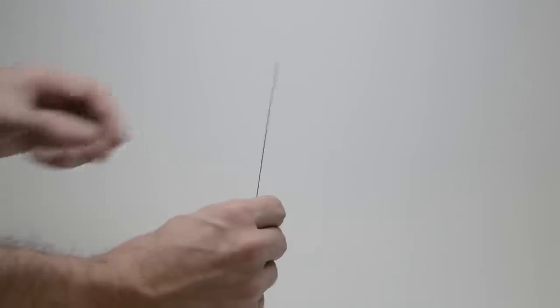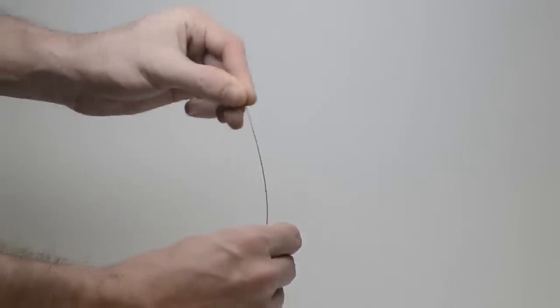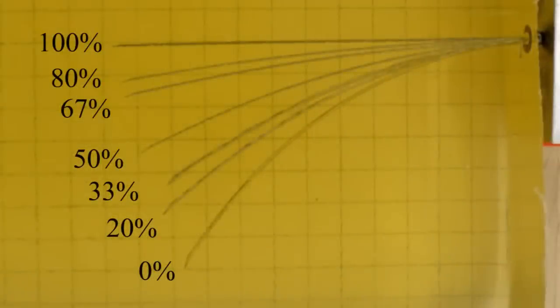The needle shaft is typically made of nitinol, which is a superelastic material and retains its original straight shape even after being significantly bent. In order to steer the needle, researchers have used the duty cycling method, where the needle will be rapidly rotated for a period of time, and then inserted without rotation for another period. The rapid rotation causes the needle to go straight, while the insertion without rotation causes the needle to insert along a circular arc. By varying the amount of time each of these steps is done, researchers have achieved a controllable, steerable needle.